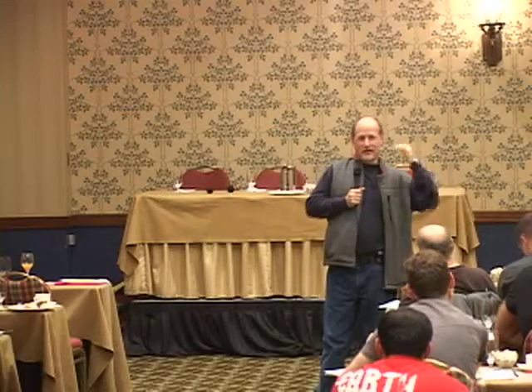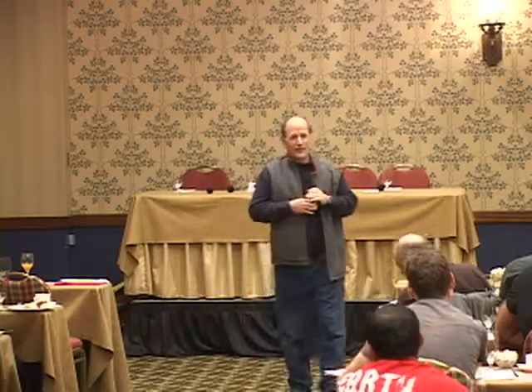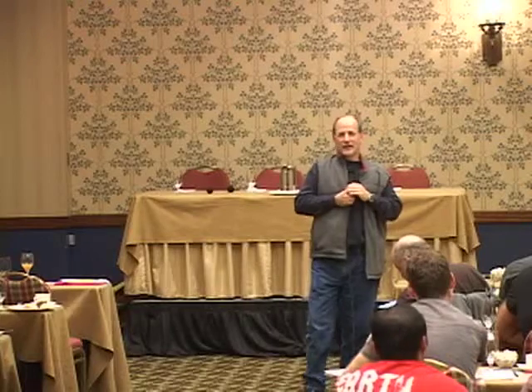I actually had a very similar case of this a week ago. 70-year-old lady comes in. She's got a history of heart disease, no history of PE, and had exactly this. Since last night, she's just suddenly short of breath. And the shortness of breath has persisted through the night. She doesn't look like she's in failure. Chest x-ray doesn't look like she's in failure. We got a triple study on her, and she had a PE for the first time ever. So we could have just gone with CT, the regular chest CT, but the opportunity was there to nail it. Oh, I forgot. The other reason we did the triple study is she had a history of a thoracic aneurysm. We knew that, so we wanted to take a look at that and see if it had progressed.